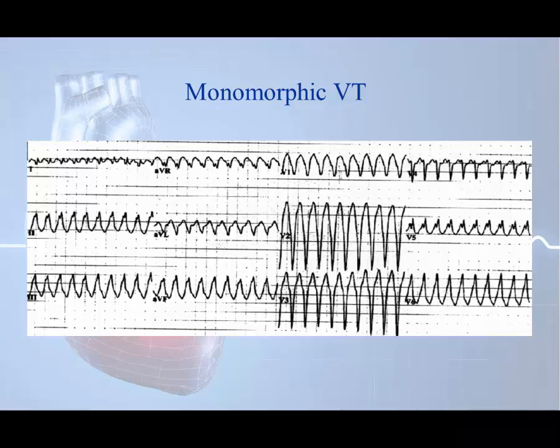So monomorphic VTAC, it kind of looks the same. Monomorphic VTAC is a form of ventricular tachycardia in which the shape of each beat on the EKG matches the others. The common cause is tissue scarring from a previous heart attack. If ventricular tachycardia is stable with adequate perfusion, we're looking at the treatment: high flow O2, IV, 12 lead prior to and after treatment conversion if possible.